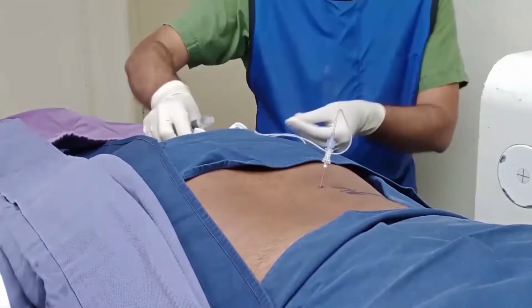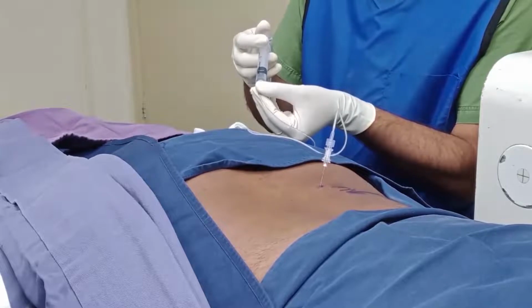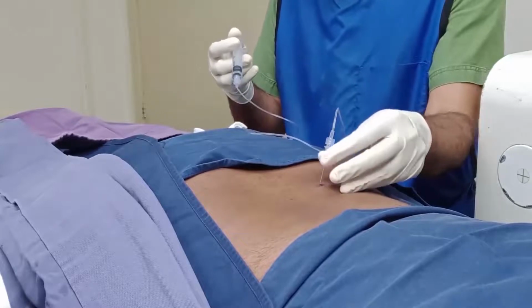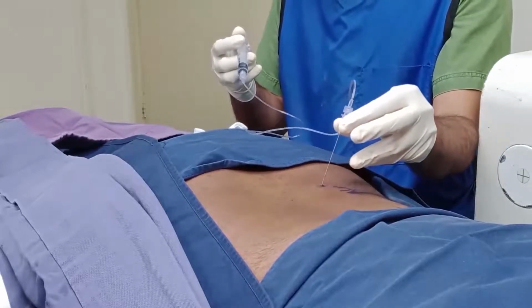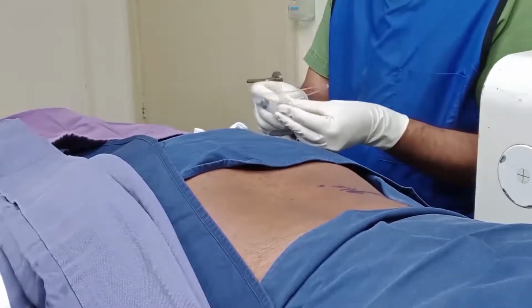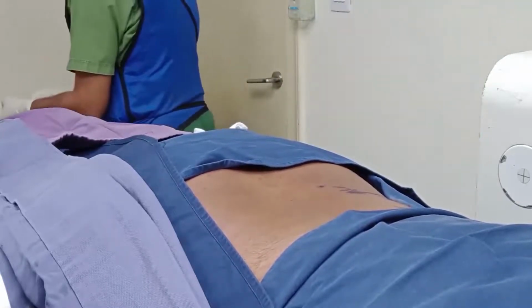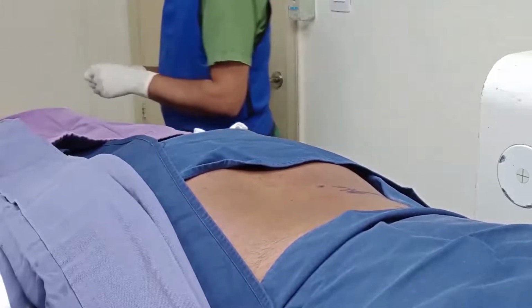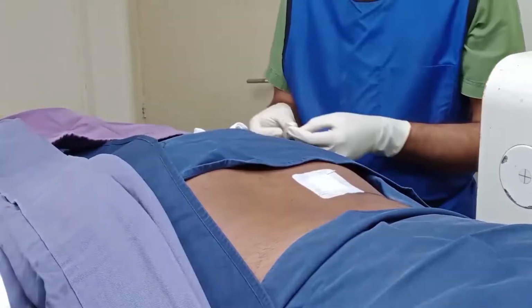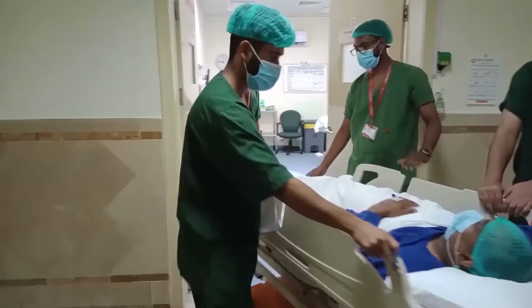With normal saline, the extension line is flushed to ensure that the maximum drug is being deposited in the area of interest. So now we have finished the transforaminal epidural injection, and the insertion site is covered with a sterile dressing, for further monitoring and to give the discharge plan.